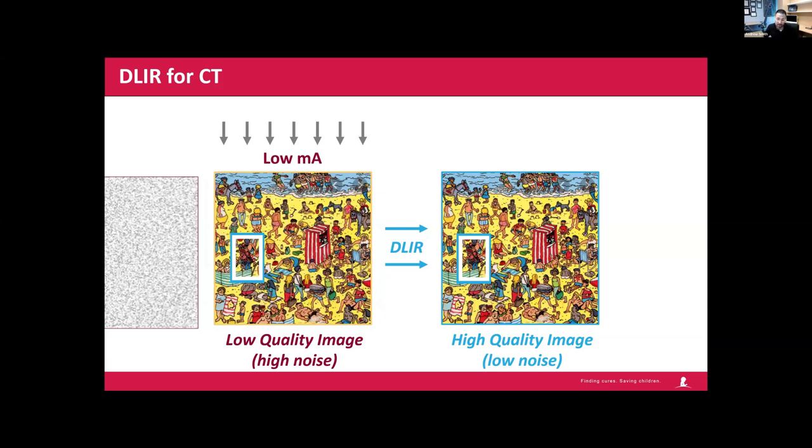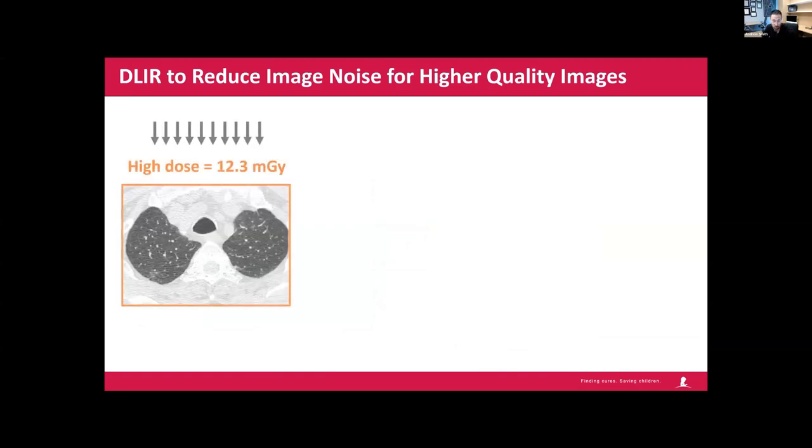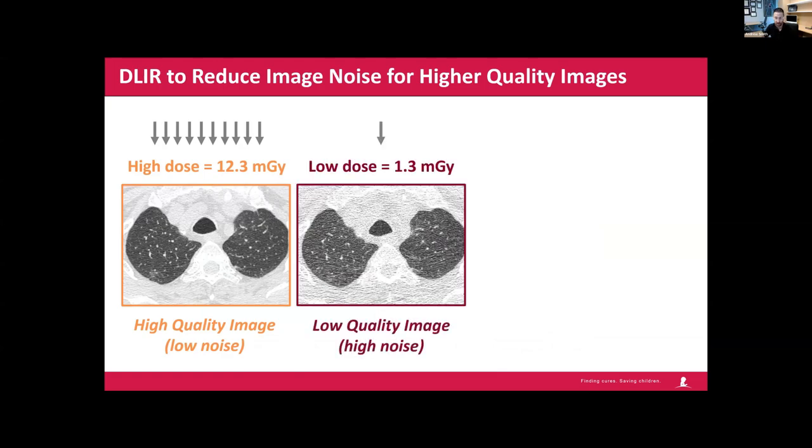Now, we'll look at some actual CTs. It's not this dramatic. This is meant to sort of sensationalize it a little bit, but the improvements are not that dramatic, although I do think they're important. So if you did a high dose scan, or full dose scan, you would get a beautiful looking image, the apices of this lung. If you did a low dose scan, we don't do lung cancer screening like this that often in pediatrics. There are some times where you do, but it's less common than adults.